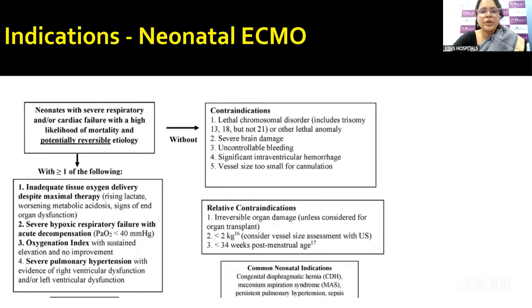So, as we all know, neonatal ECMO is one of the highest end cardiorespiratory support therapies that are offered, and hence this is only reserved for neonates with severe respiratory or severe cardiorespiratory failure with high likelihood of mortality, but with a potentially reversible pathology like meconium aspiration syndrome, like sepsis, or in diaphragmatic hernia awaiting surgery or immediate post-op where there is PPHN.